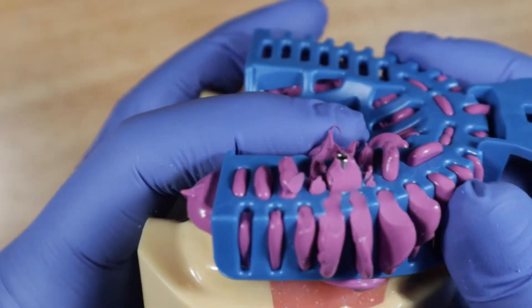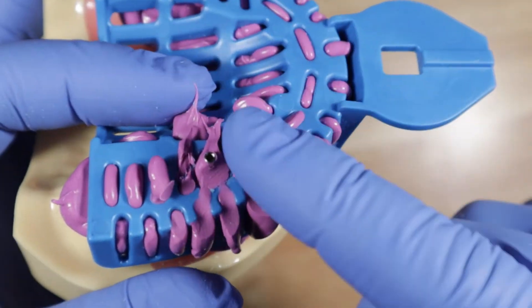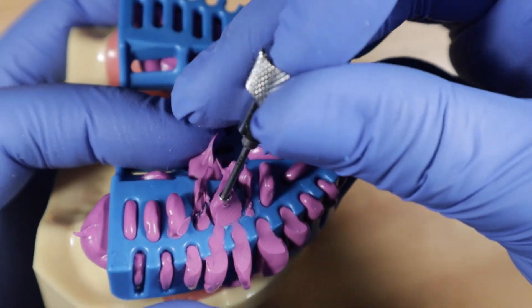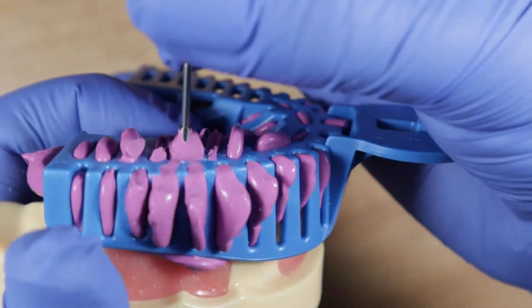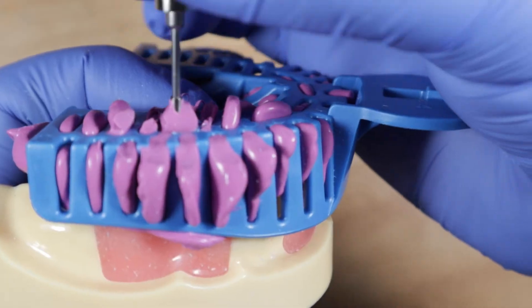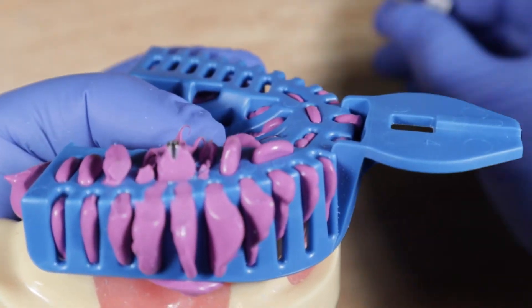Once the impression material has set, find the impression coping — it sticks out through the impression material because you cleared the impression material from the screw access. Now go ahead and unscrew it, and keep going until you hear a clicking noise. That clicking noise tells you the screw is completely untightened.